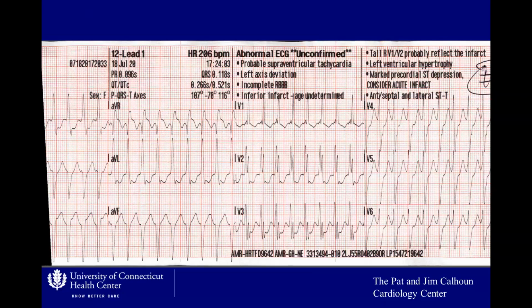That's a good point. I would think this is still idiopathic ventricular tachycardia, not scar-mediated. I would expect that this tachycardia would be much, much wider if you have a lateral infarct. I would expect in this area here a very wide QRS complex. I would expect in aVL a very wide QRS complex. So I think this is still idiopathic ventricular tachycardia, which you can still have, obviously, even if you have a scar in this lady.